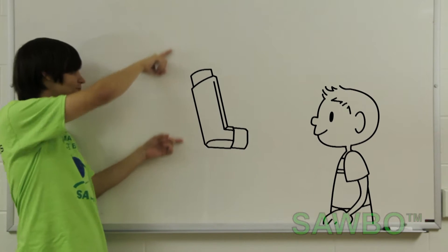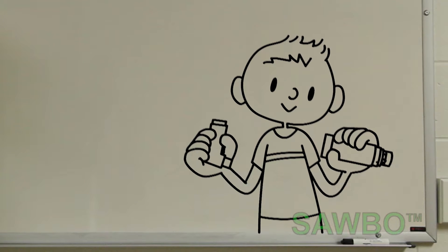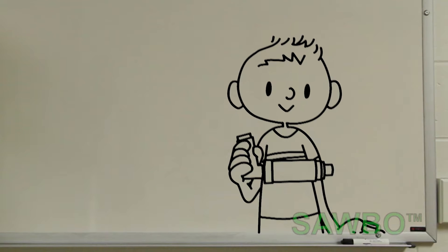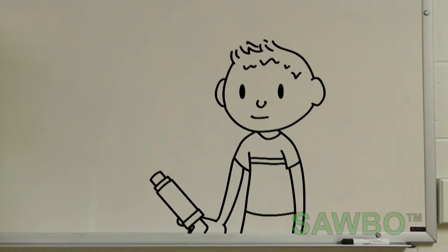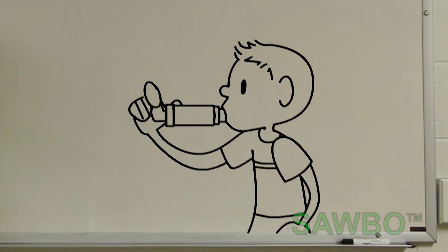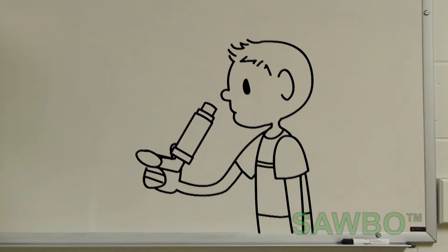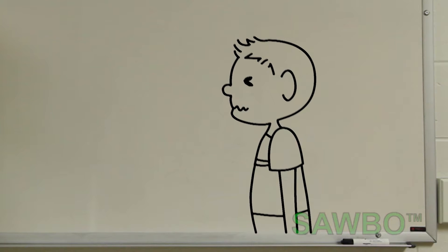Timmy will take it from here. First, place the inhaler in the back of the spacer. Then, remove the cap from the mouthpiece of the spacer. Breathe out completely. Next, place the spacer in your mouth. Push down on the inhaler cartridge once and breathe in slowly and deeply. If you hear a sound, this means you are breathing too quickly. Remove the spacer and inhaler and hold your breath for 10 seconds.